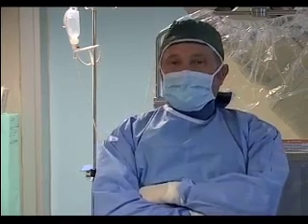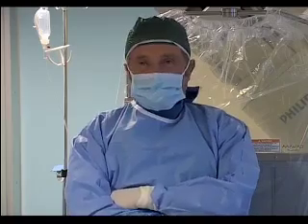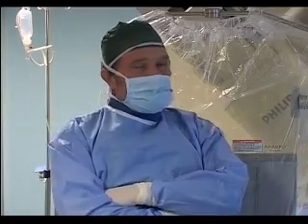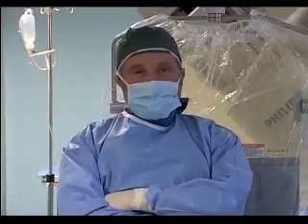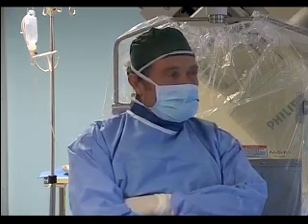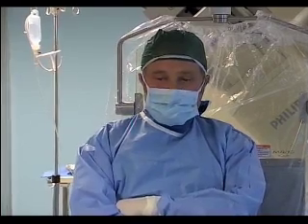A third comment will be ADO2 AS. You will get good results also with the coil. With coil? Well, you might have to put more than one coil in order to get rid of any possibility of hemolysis. So I think you want to finish up with a single device. I wouldn't put a coil, but... Well, that's probably because in the US you have coils only, almost.